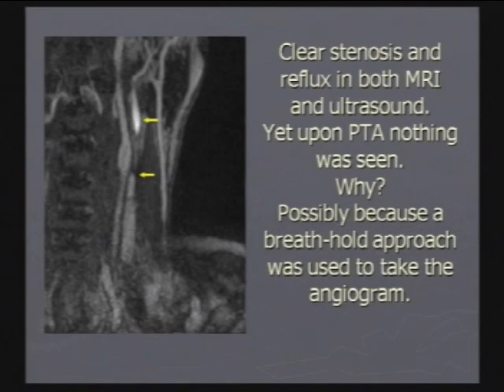And yet, when they went in with the catheter, went up to the top and injected, they found nothing. So the conclusion was that there wasn't a problem there. And my personal feeling is there's a problem there. So the question is, how you do this procedure may be important. I believe they also used a breath hold when they did this. So they had the person hold the breath and injected.